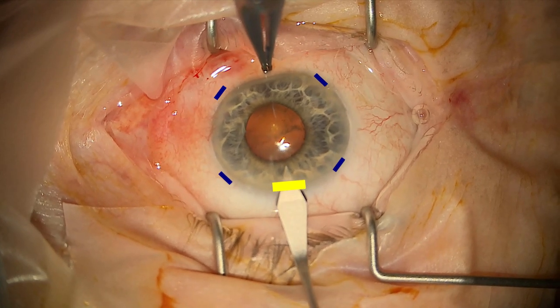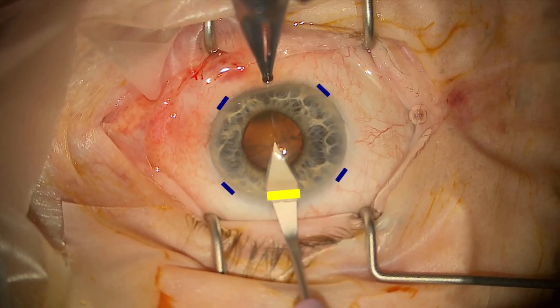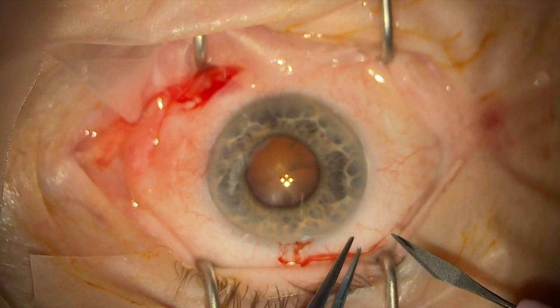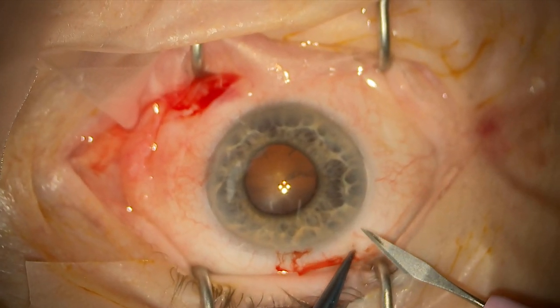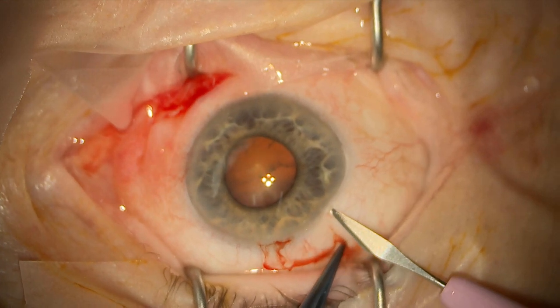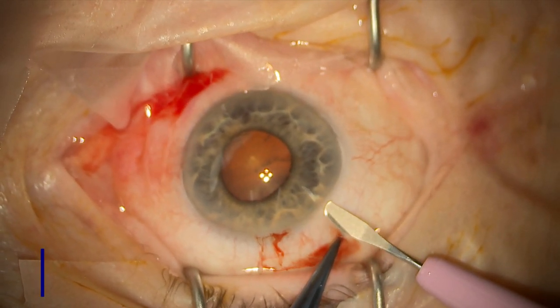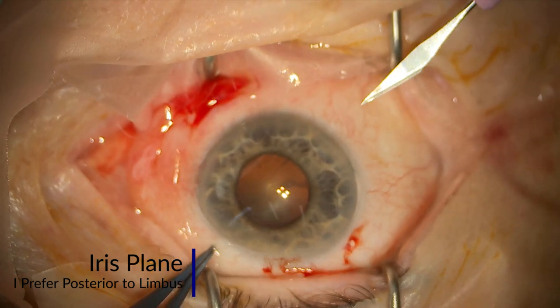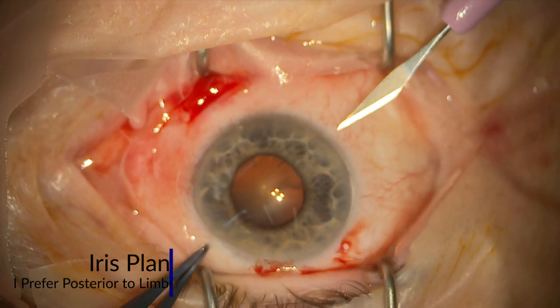There is some variability in positioning of the incision for the iris hooks. You can go corneal or limbal. I prefer to go slightly posterior to the limbus, but I think the main principle is the same: you try to keep in the plane of the iris just to allow a good angle for the iris hook to bring the iris back without causing any damage.